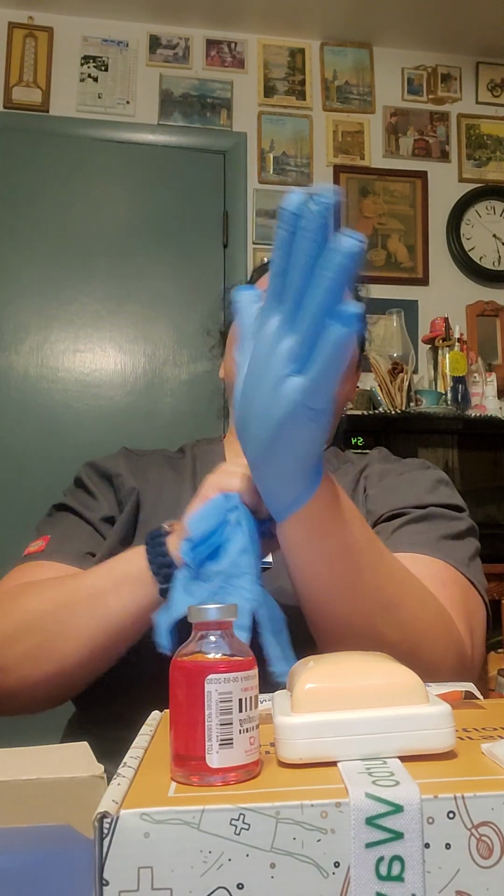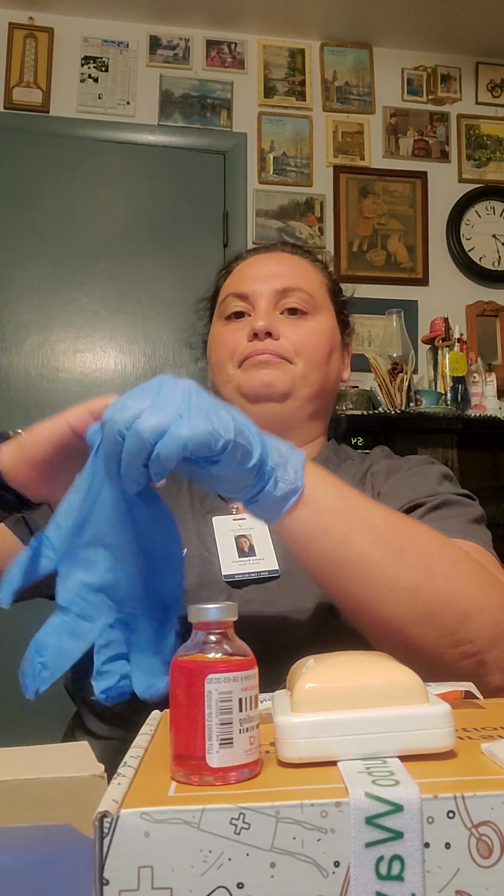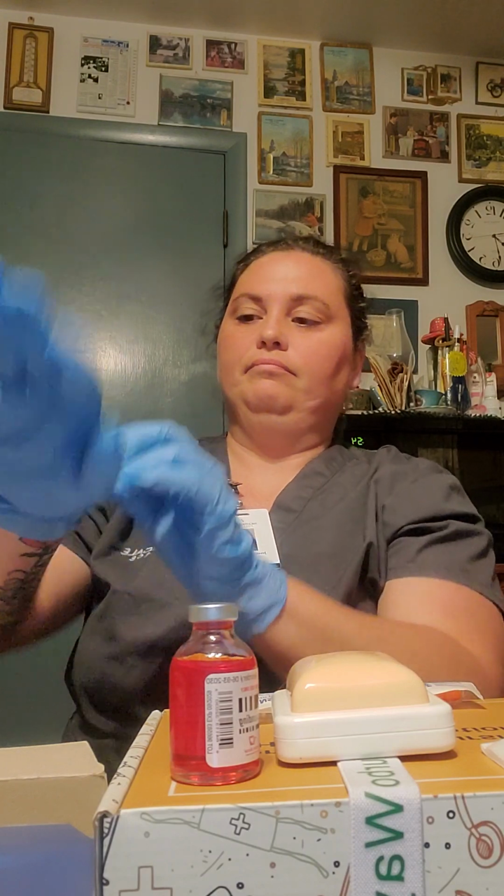Once I got that, I would ask them if they had any allergies. Do you have any allergies to anything? No? Okay, great. So after the allergies are asked, I will then do hand hygiene. I will then get my gloves. I will put my gloves on. And then I can begin here.